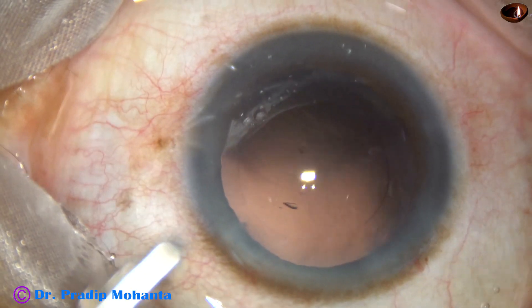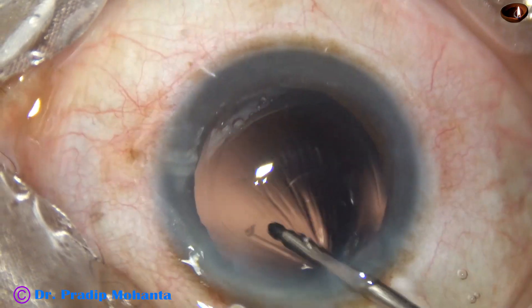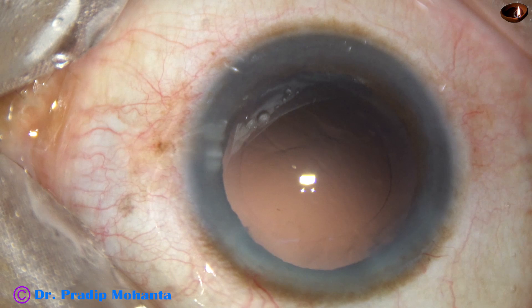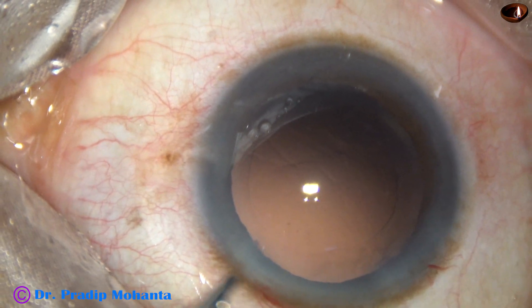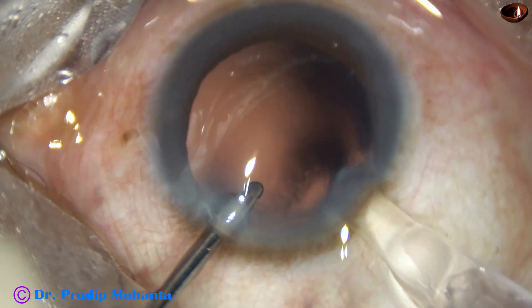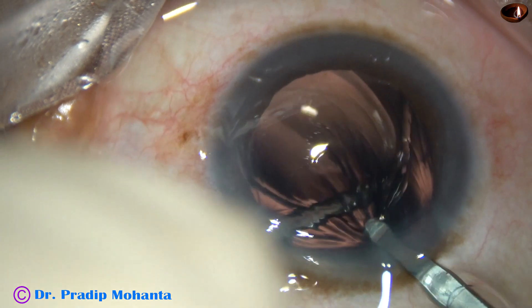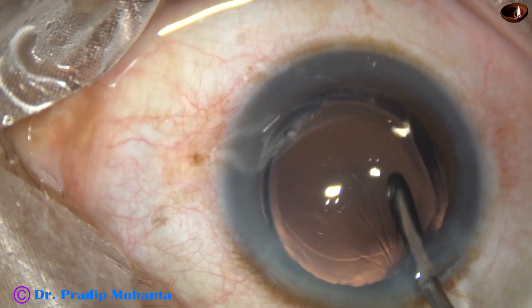And now, there are some lens fibers sticking to the posterior capsule. And this is hydropolish, using the irrigating jet of fluid for polishing of the posterior capsule. Now, this is hydroimplantation of a monofocal foldable intraocular lens. The leading haptic goes into the capsular bag and the trailing haptic is pressed into the capsular bag by the left-hand instrument.